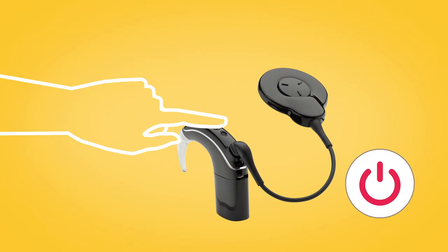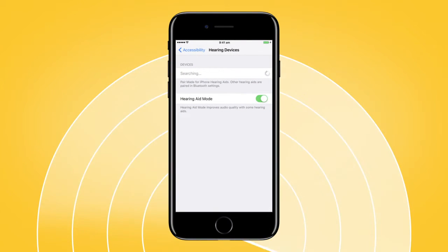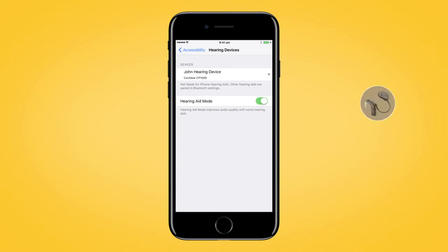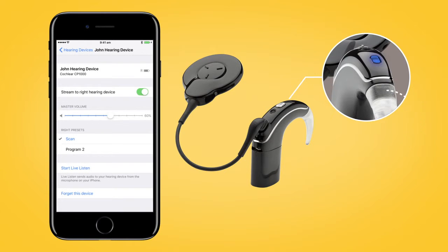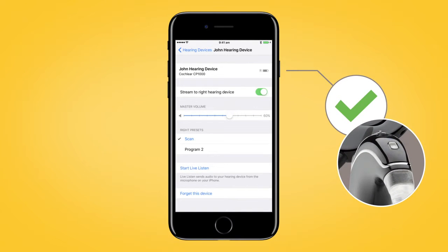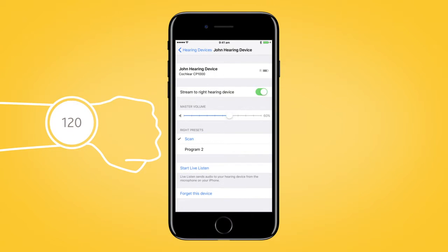Next, turn your sound processor off and back on again. Your Apple device will then search for your processor and display it in the Devices section. Select the name of your processor and tap Pair. You will hear six beeps to indicate that pairing has started. The sound processor light will flash blue for four seconds. Pairing is finished when you hear a ripple tone and the sound processor light flashes blue for another four seconds. The pairing process may take up to 120 seconds.